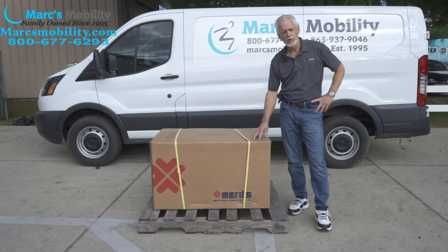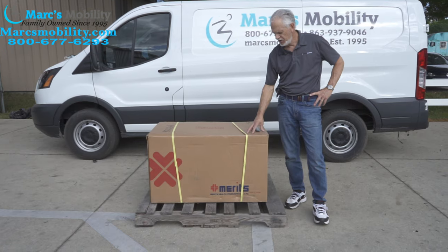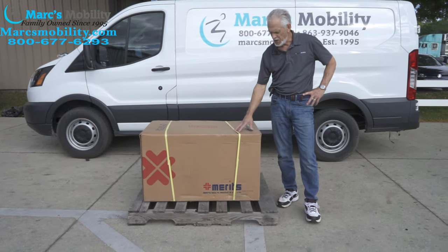Alright, we have here a Meritz Dueler, the P312 with the seat lift. This is a power chair, the Meritz P312 with the seat lift in the box.